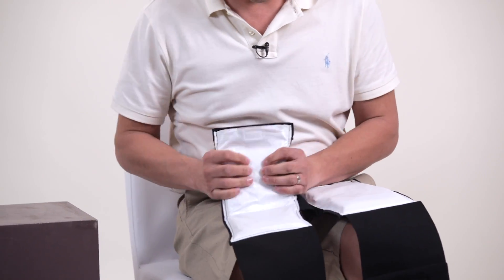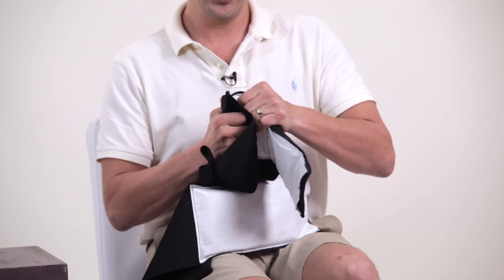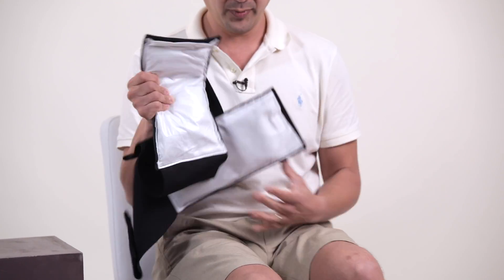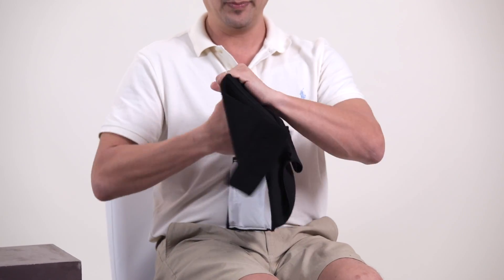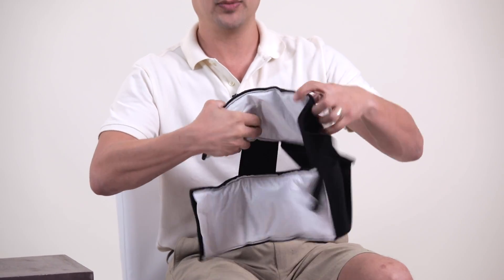Since we want to go around a smaller area, we want to make sure that the gel bags are nice and soft and moldable. So we do a little manipulation here if need be, depending on how long it's been in the freezer.